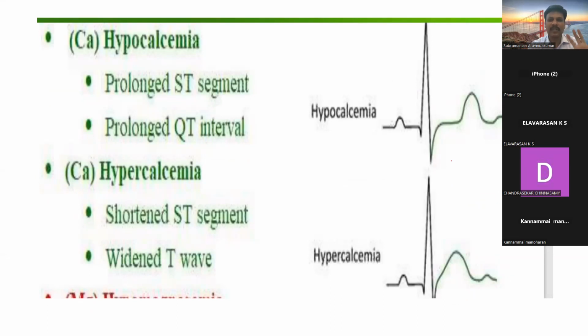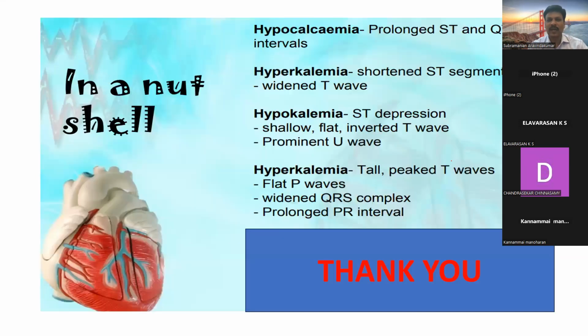Now with these ECG findings, you can easily make a diagnosis of electrolyte abnormality on ECG. Predominantly, the history helps you out. The patient will be in renal failure or on diuretics, or in acute renal failure, with either hypocalcemia or hyperkalemia. In case of diuretics, you have hyponatremia, hypokalemia, and in case of hypercalcemia, usually an endocrine abnormality, tumor lysis syndrome, or hyperparathyroidism can cause these features.